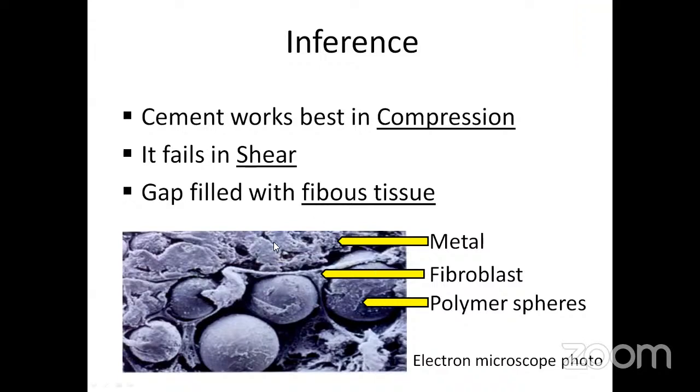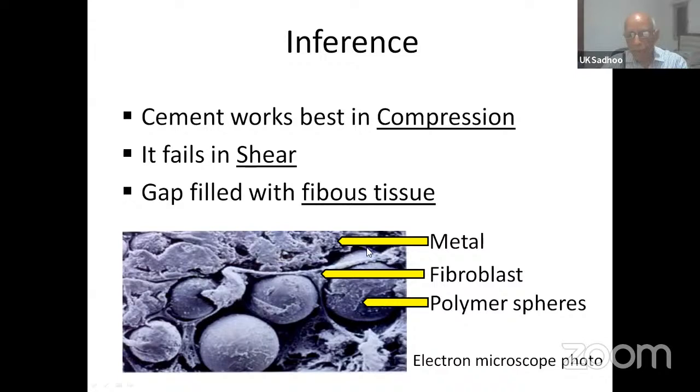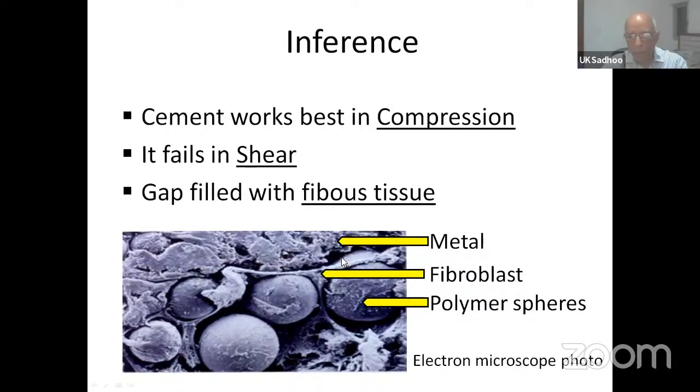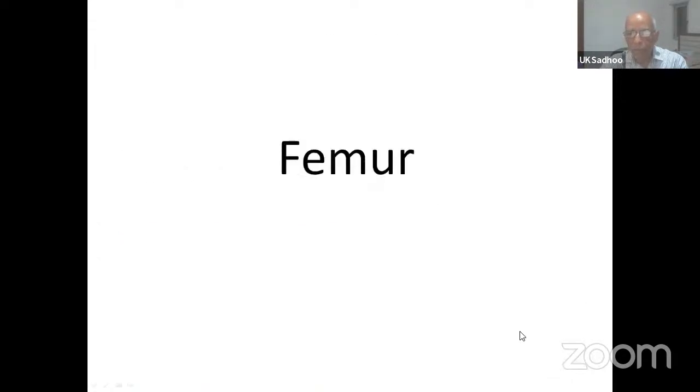Now, this is an electron microscope picture of the composite. Here is the metal. Here is the polymer, the cement, and this is the fibroblast. Any gap between the metal and the cement would be filled by fibroblast. That is, so long as there is an intimate contact with the bone on one side and the prosthesis on the other side, we should have a damn good working composite here. So let's start with the femur first.